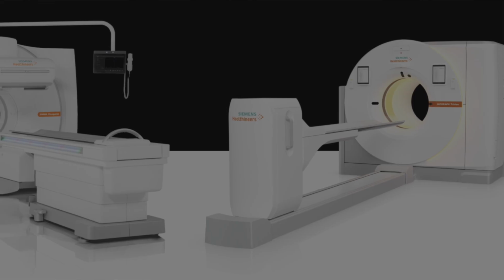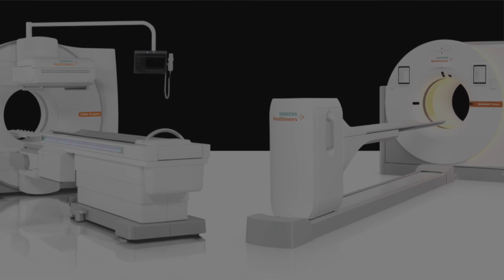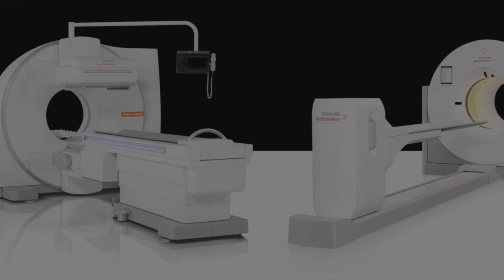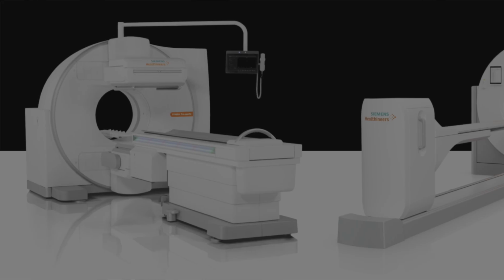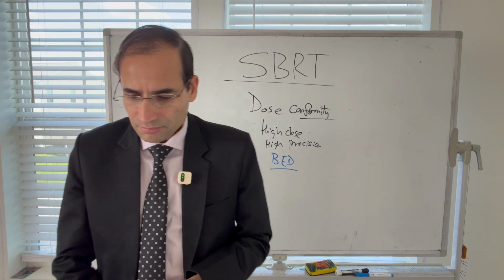Nowadays we have the PET CT, so we'll come to that topic. PET and CT can even be done in a single machine. You don't need to go to a PET machine and then to CT, you can do both PET and CT nowadays with technology. Very efficient and very accurate.